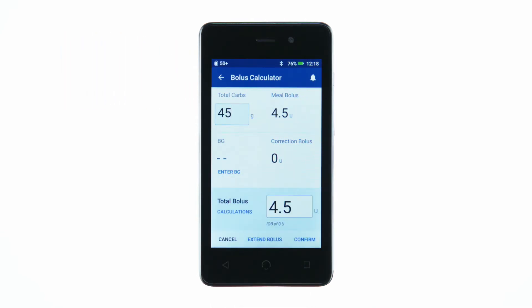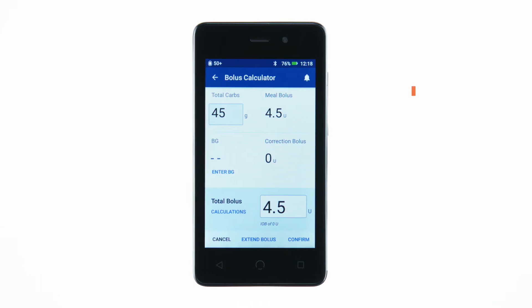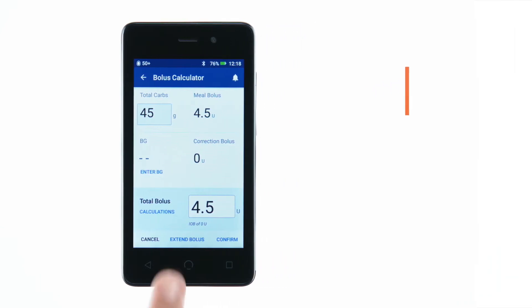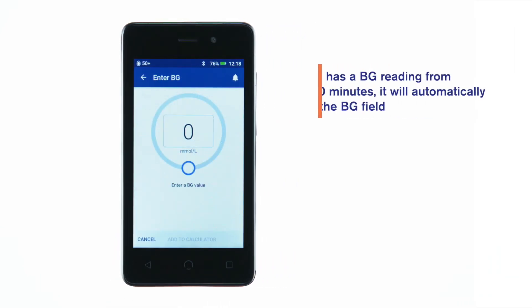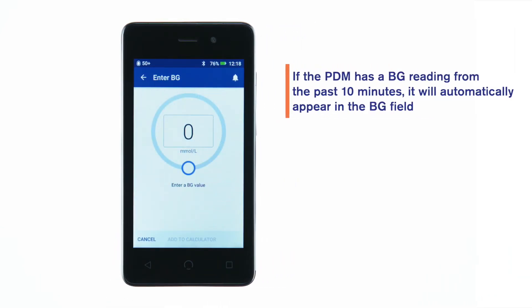Then enter a blood glucose reading by tapping Enter BG. To manually enter a blood glucose reading, tap the box inside the circle and enter the BG reading.